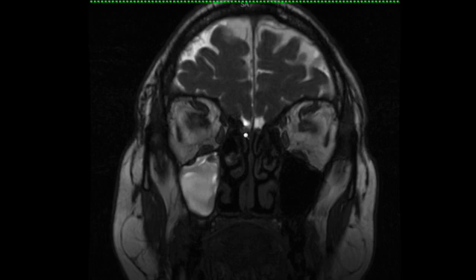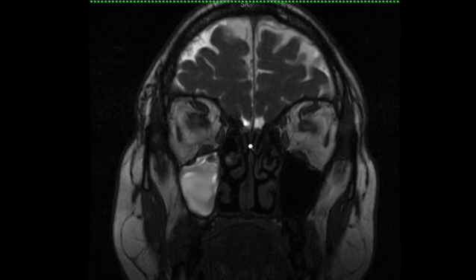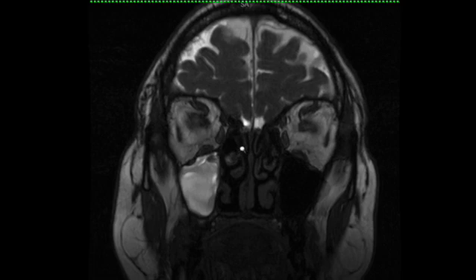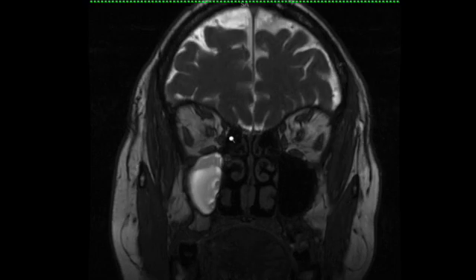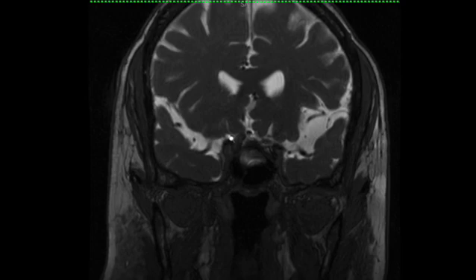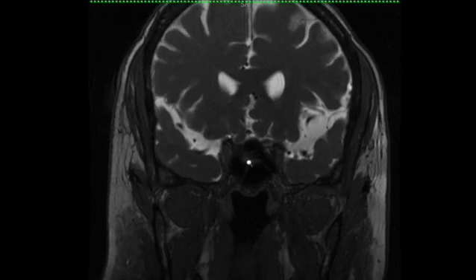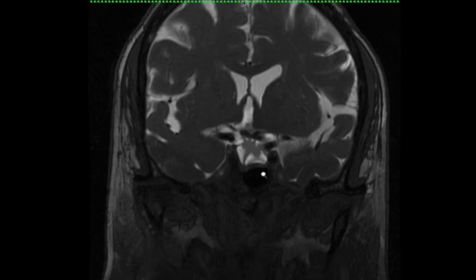Surgical management will have to clear all this area and we will have to cover it. We have to remove the interseptum and make one continuous big patch. As we proceed posteriorly, I would like to show you this — this is the sphenoid. As soon as we enter the sphenoid, we start seeing the sella. Can you see the hyperintensity in the sella?